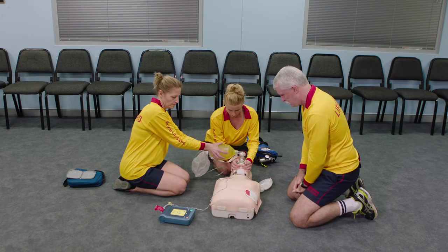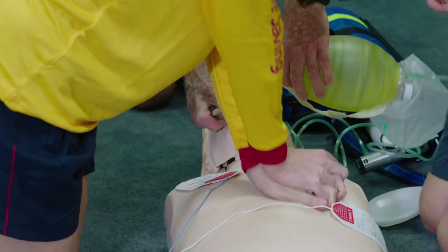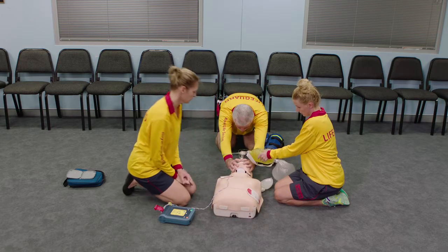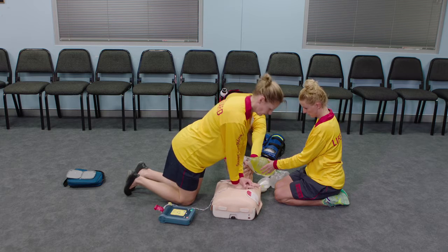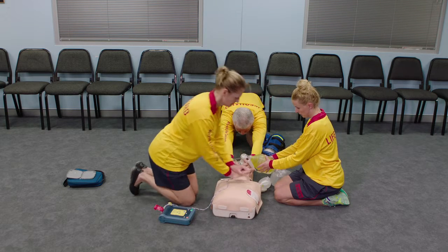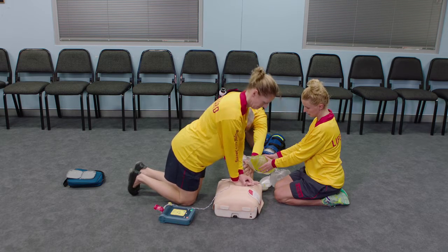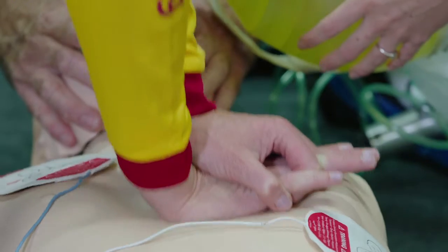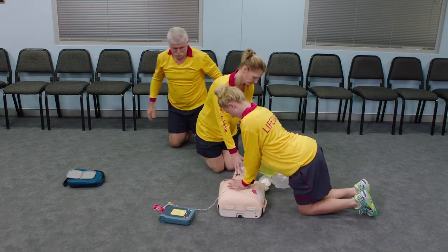The chest should rise each time the bag is being compressed. If lifeguards need to change roles, there should be no change to the time it takes to resume compressions.